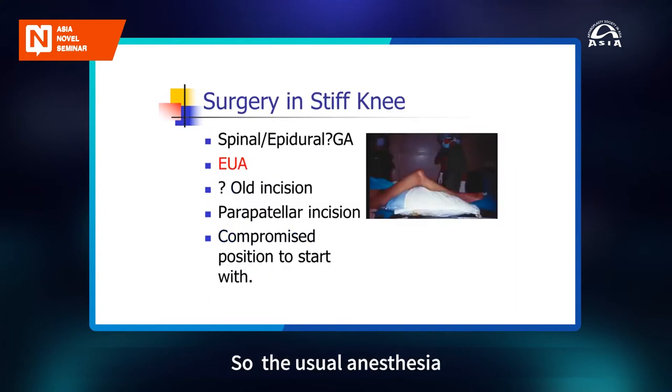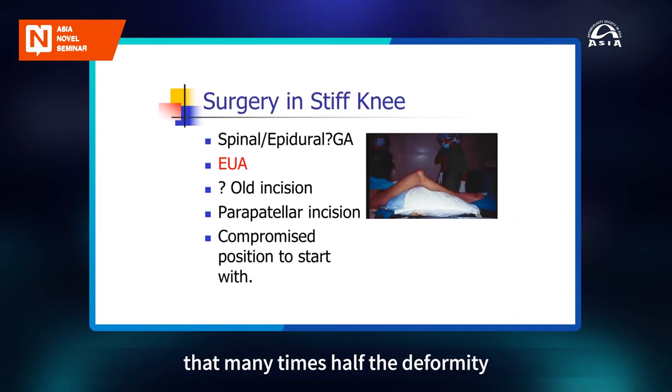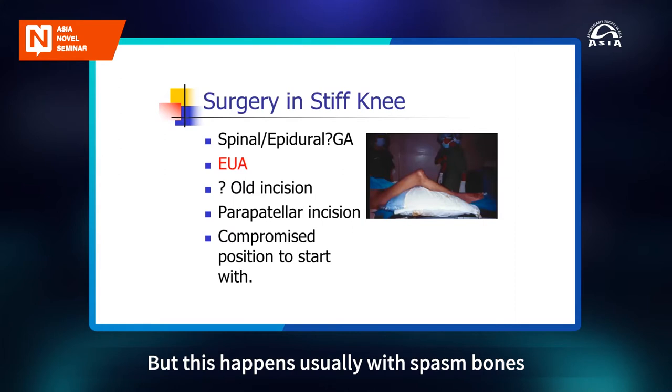So, the usual anesthesia, and before you start, look in red. Examination under anesthesia is extremely important because you will be pleasantly, happily surprised that many times half the deformity is due to muscle spasm. After anesthesia, when you straighten the leg, your job becomes much easier. But that doesn't mean that you prepare to work on that premise. You prepare to work on the worst case scenario, but usually the spasm goes.